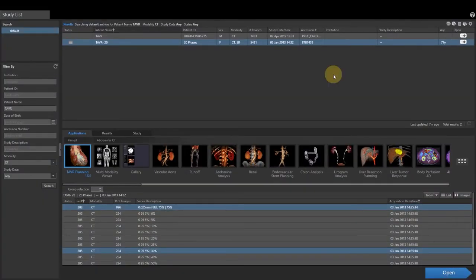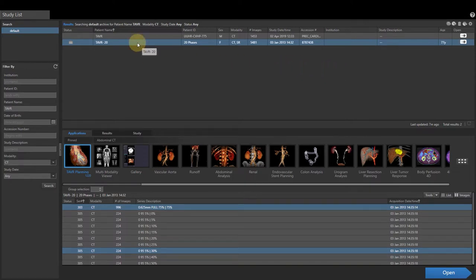This is a Vitreus 7 workflow demonstration video reviewing the TAVR planning application. From the study list, left-click to select your patient. From the application selector, left-click to select the TAVR planning application.